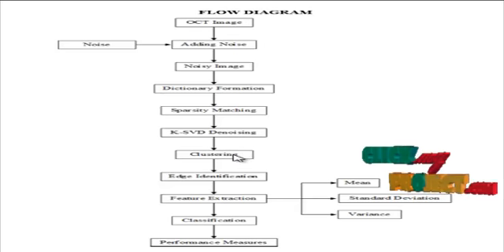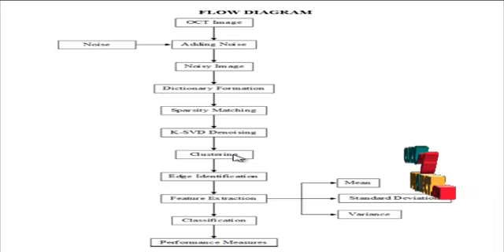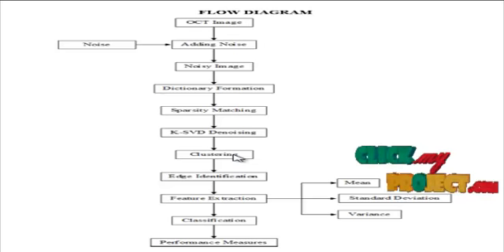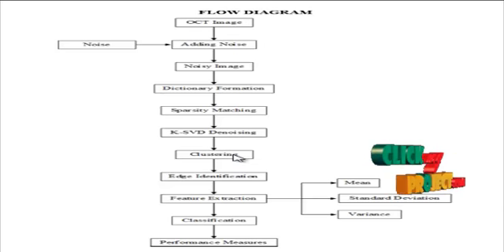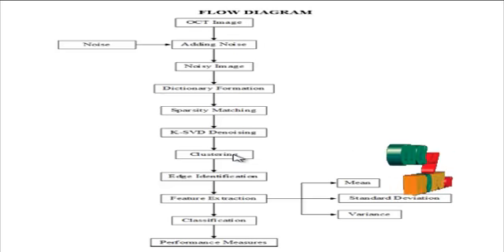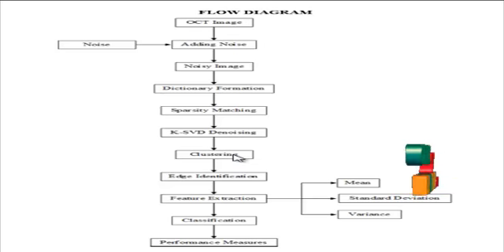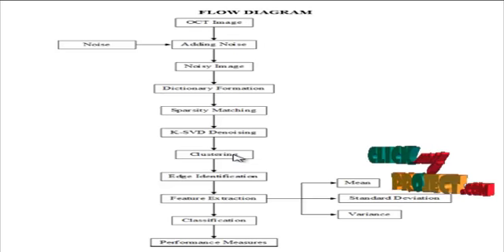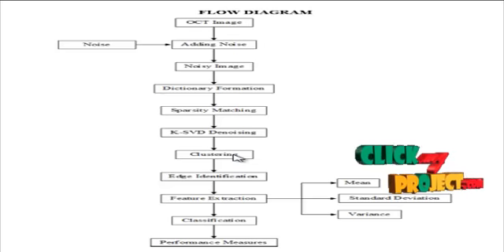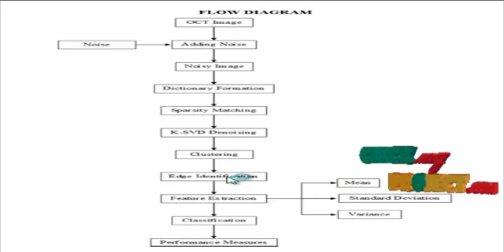The estimated noises from the images were removed, resulting in the denoised OCT images. Then the clustering process is employed. The regions in the images that have similar intensity are clustered using the fuzzy C-means clustering algorithm. Any point in the image has a set of coefficients giving the degree of being in the kth cluster. In fuzzy C-means, the center of the cluster is the mean of all the points weighted by the degree of belonging to the cluster. Each cluster region represents regions of different density. Finally, the edges of the cluster regions were identified.